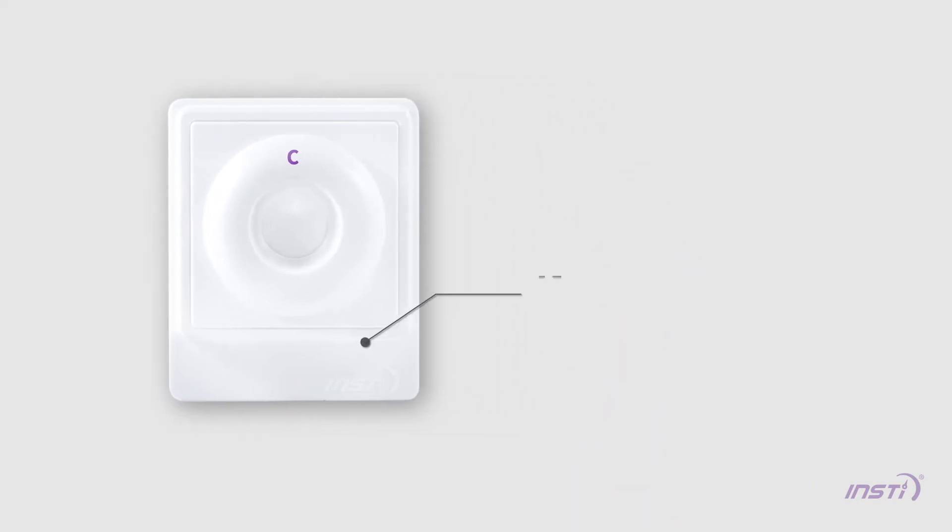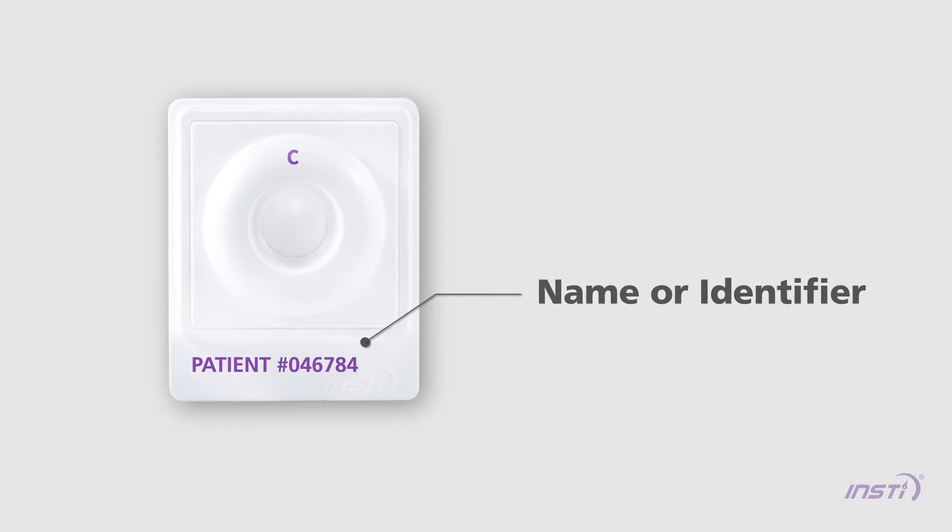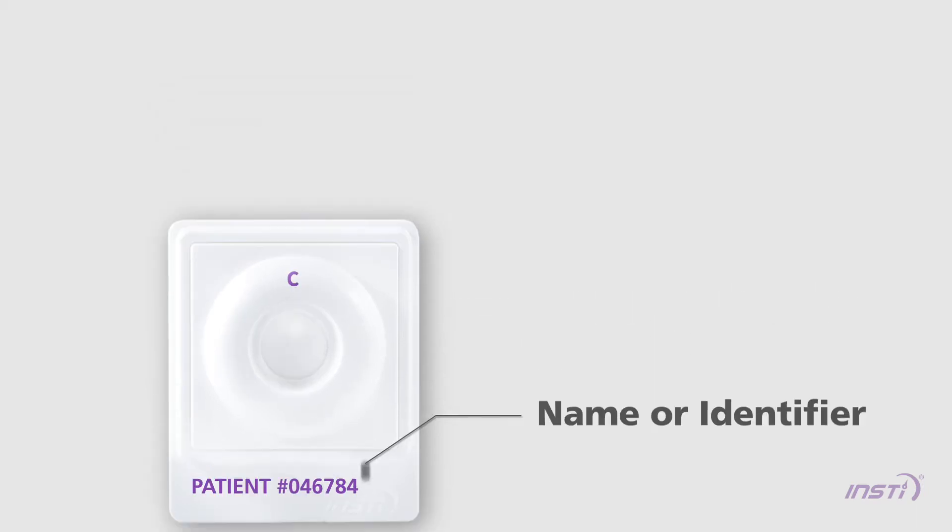For sample identification purposes, the tab of the membrane unit may be labeled with the patient's name or identifier. Use of the workstation is optional. If the workstation is not used, place the membrane unit on a flat surface.